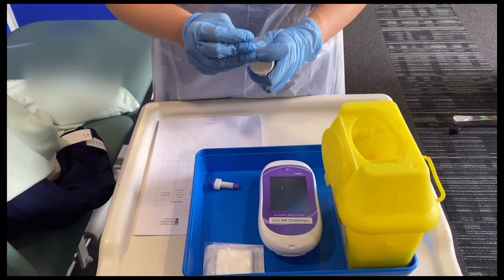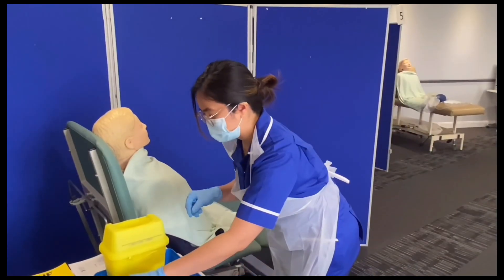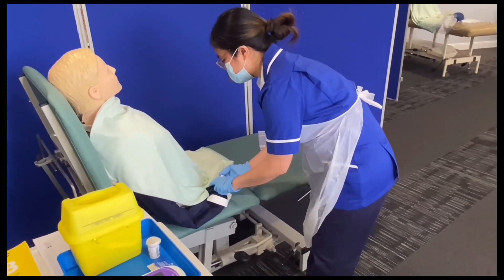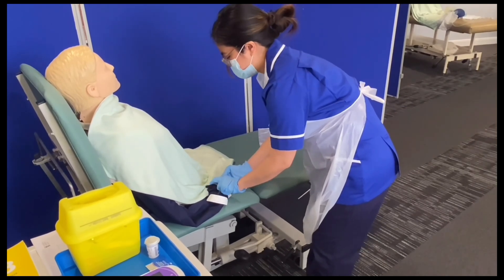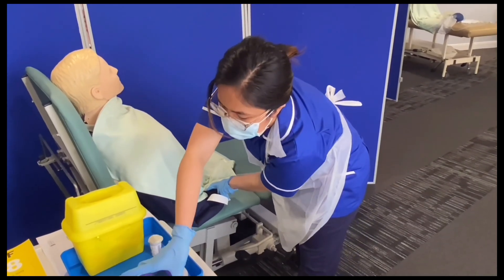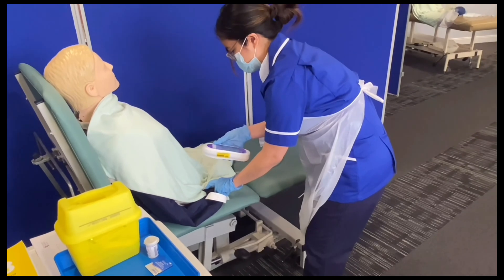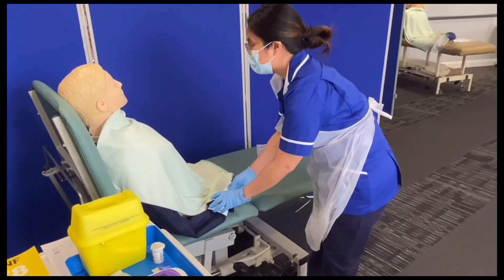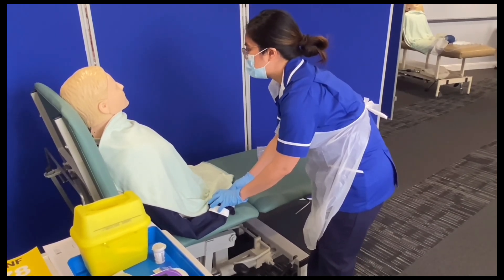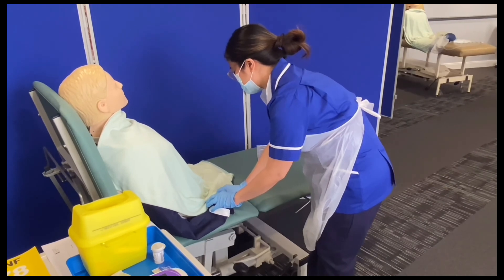I'll get one glucose strip and put it in the glucometer and wait for it to be ready. I'll get my single-use lancet. You will feel a bit of a sharp scratch when I do this — are you happy for me to proceed? You can. Sharp scratch. And I'll put this in the sharps box. Now we're going to get the blood. Your blood sugar level is 5.5 millimole per liter. It's within normal range because normally we would expect 4 to 8 millimole per liter. I'm just going to put the gauze on the side of that finger to prevent further bleeding.